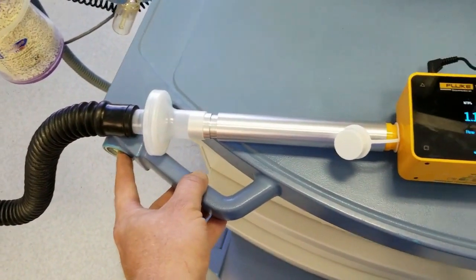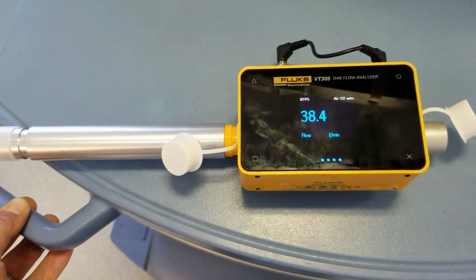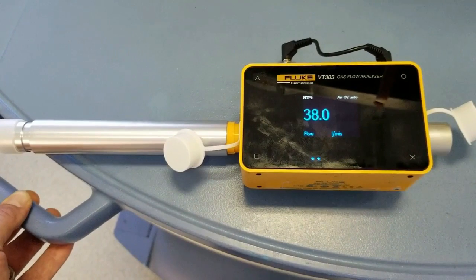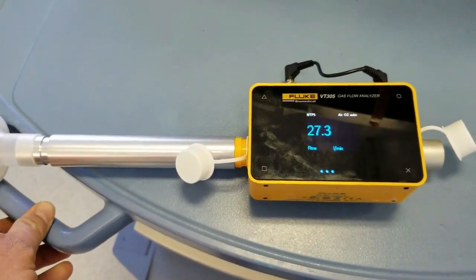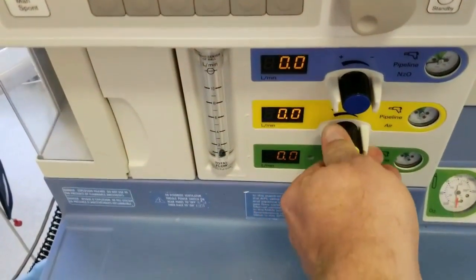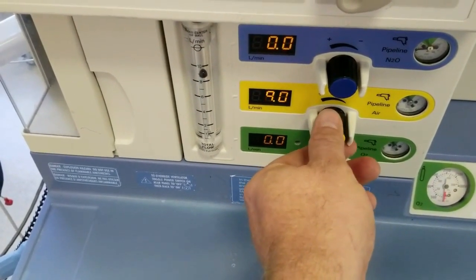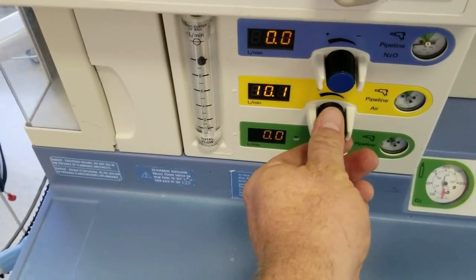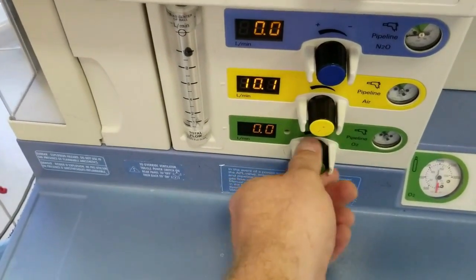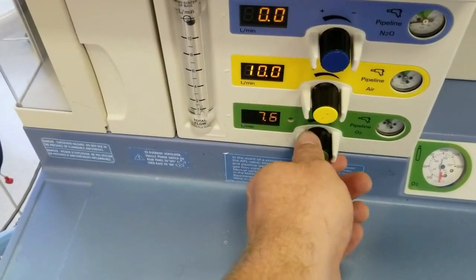I'm going to depress the O2 — that's my flush valve — so I'm flushing at 38.0 liters a minute. Now we'll do a mixed gas test. We're going to turn our air to 10 and our oxygen to 10, giving us a total of 20 liters a minute.